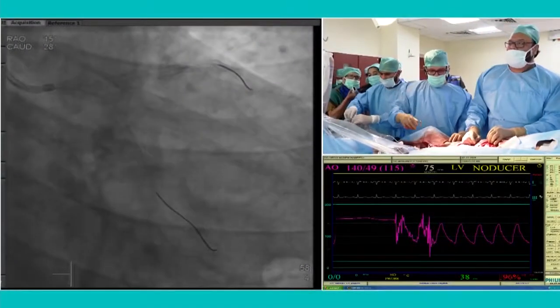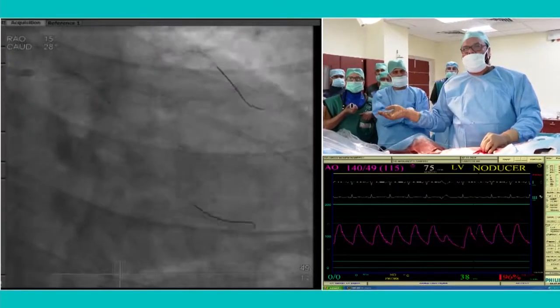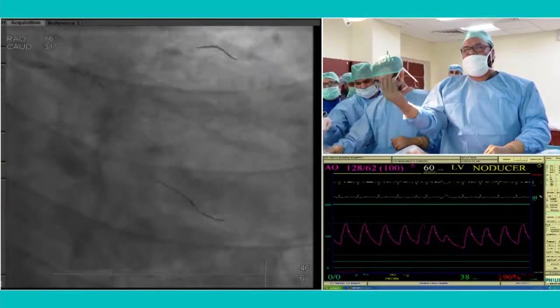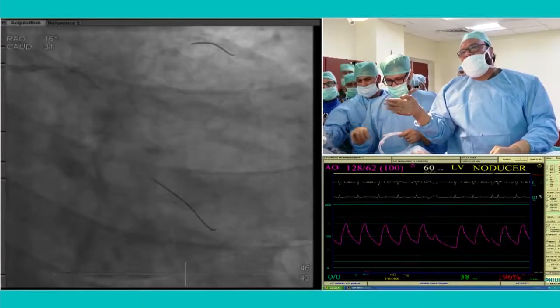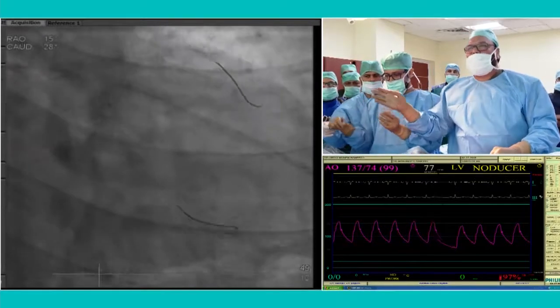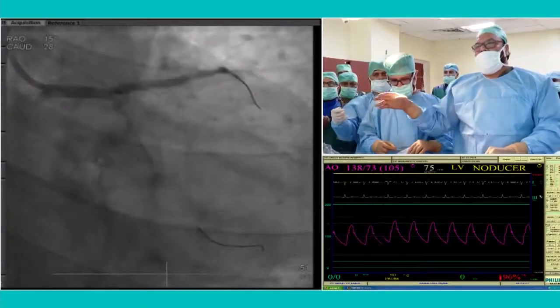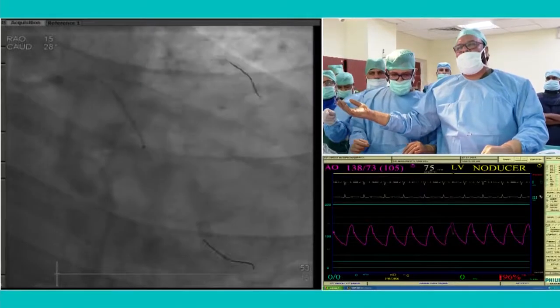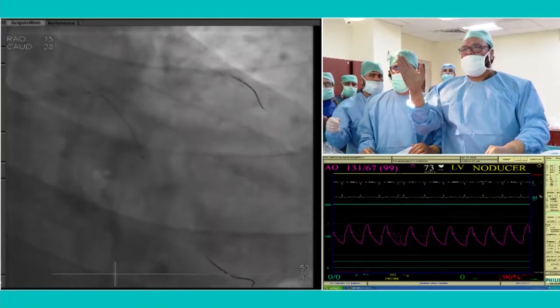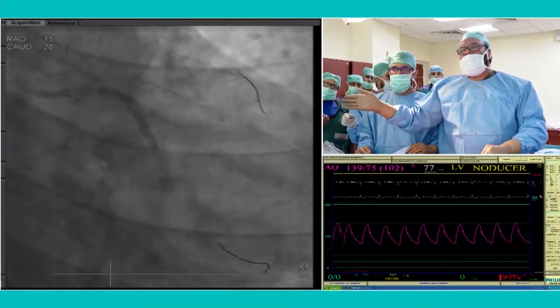We had left you soon after deploying the left main stent. I had then wired the circumflex, then opened the struts of the left main stent with a 2 millimeter balloon, and then a pre-dilatation. But the size of the vessel of the circumflex is 3 plus, so we took another balloon, 2.5, and did another inflation to prepare the lesion. And then we took the stent, a 3.0 by 28 millimeter stent, into the circumflex and a 3.5 balloon in the left main to LAD. And we did the TAP procedure. Then after the TAP, we did a kissing balloon.